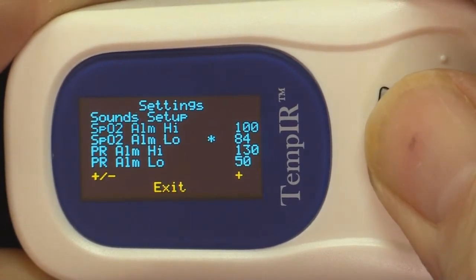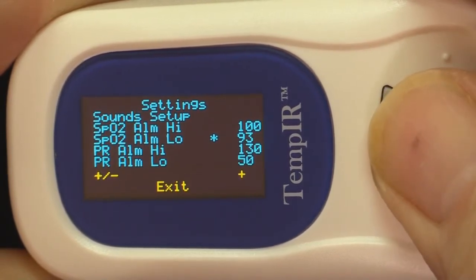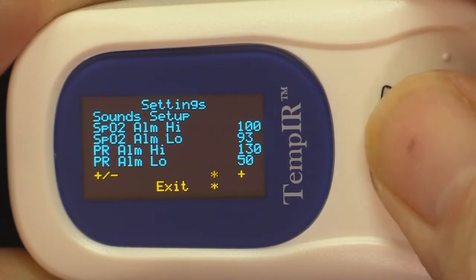Then return to the setting you want to change. Once again, holding the button down will cause the value to change automatically, and single presses will change the numbers one at a time. To return to the main screen, navigate the cursor to exit and apply a longer press.